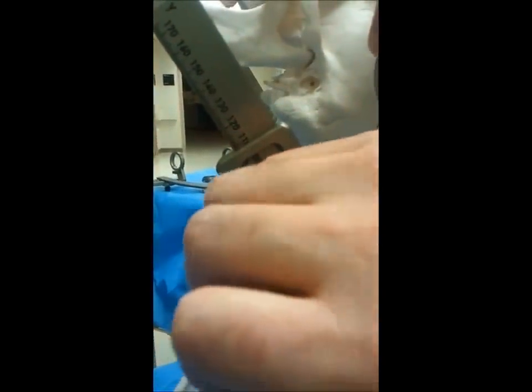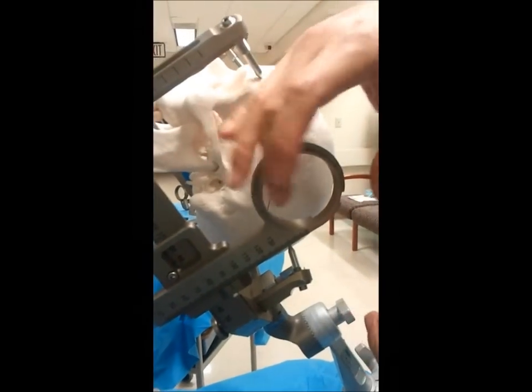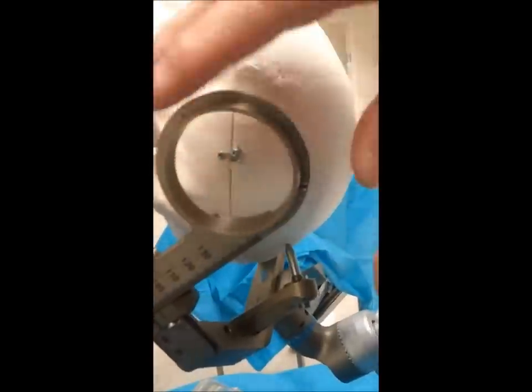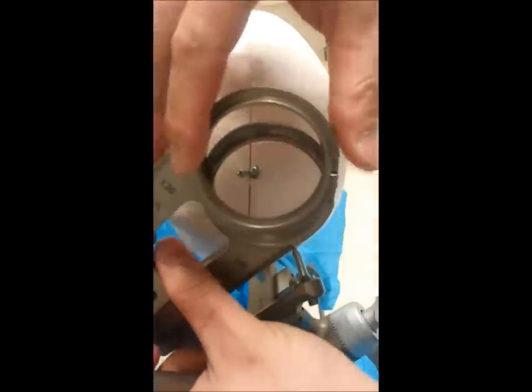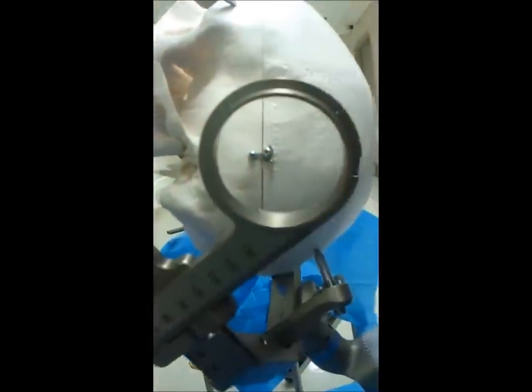As you can see, it can move, and sometimes wiggling or tapping it will get you exactly where you want — that looks pretty good on 90. We typically make the ring face forward, and if you notice here there's a notch which corresponds to the notch there. So it doesn't matter what side you're on; you could place this on the patient's right side. Just to make things easier and consistent, we typically have the ring facing forward.